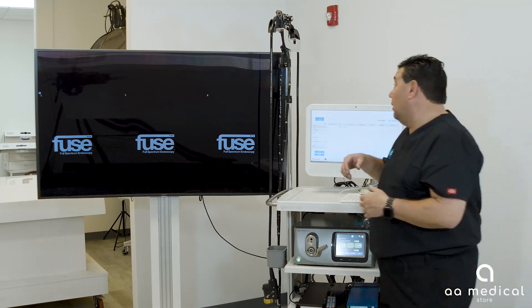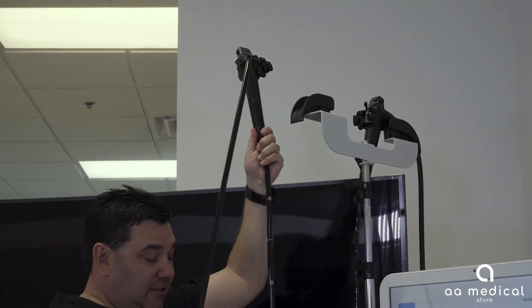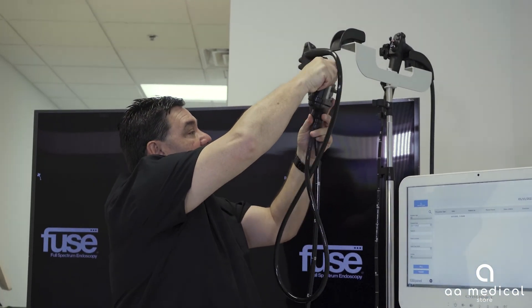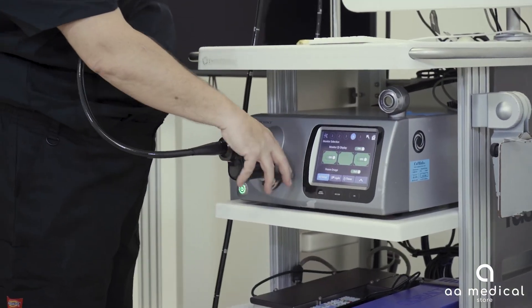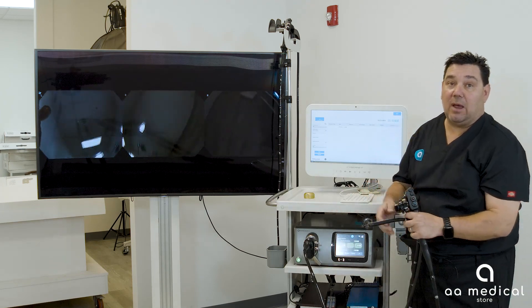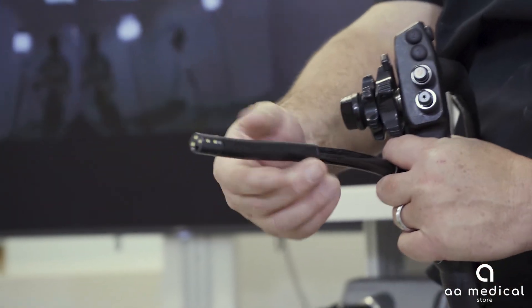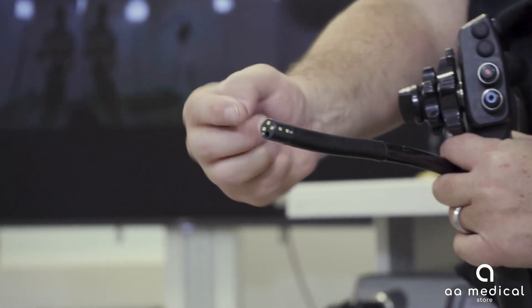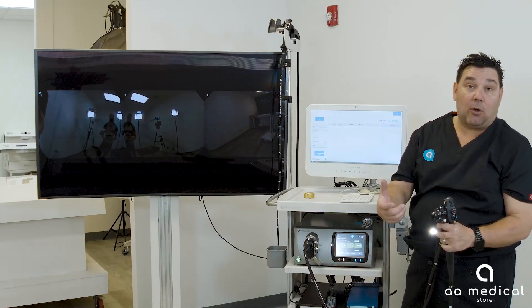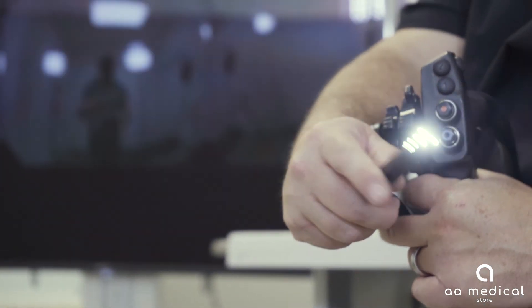Once the system is ready, grab your scope — this is a C38 scope. Remove the protective cap, plug the scope in, and lock it down. On screen you'll now see three images based on the three cameras on the end of the scope: left, center, and right. Each camera has its own LED light source, so left, center, and right each have their own set of lights.